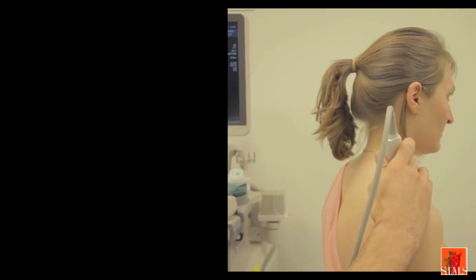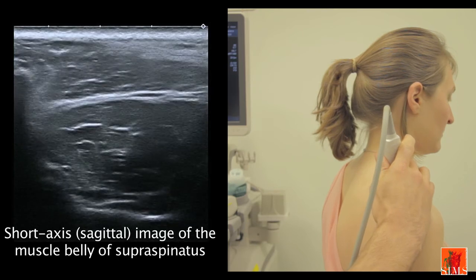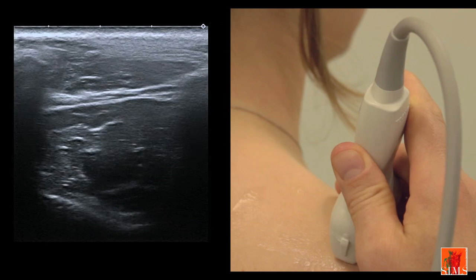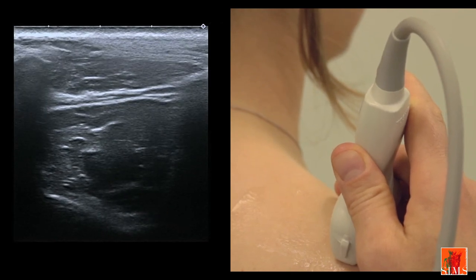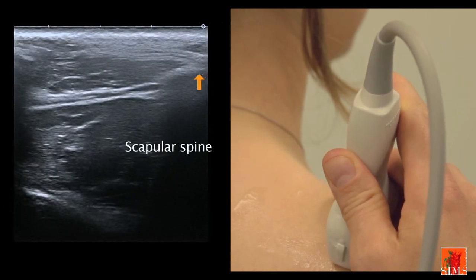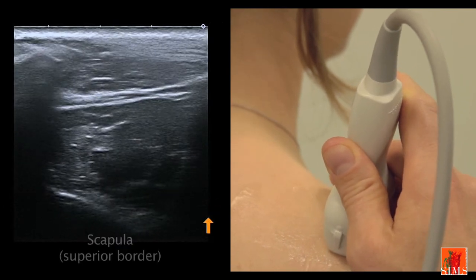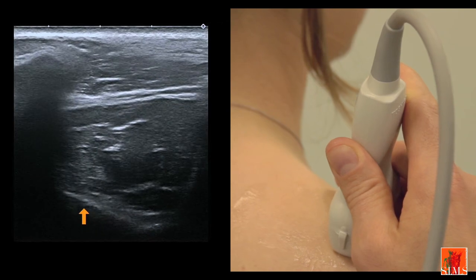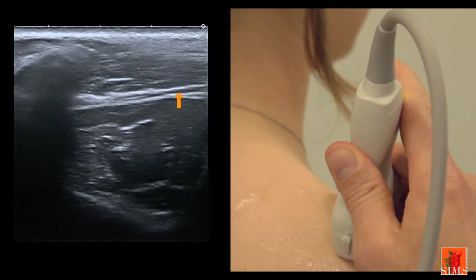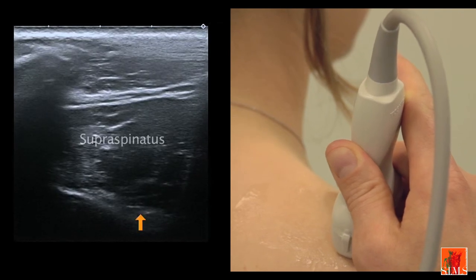In order to obtain a fine sagittal image of the supraspinatus muscle within its fossa, the transducer is placed in this way. The image must show three absolutely mandatory bony protuberances. The first is the clavicle anteriorly, the second is the spine of the scapula posteriorly, the third is the upper border of the scapula here. Superficially, you will note the trapezius muscle. Everything you see on the image beside it between the bony protuberances is in fact the supraspinatus muscle.